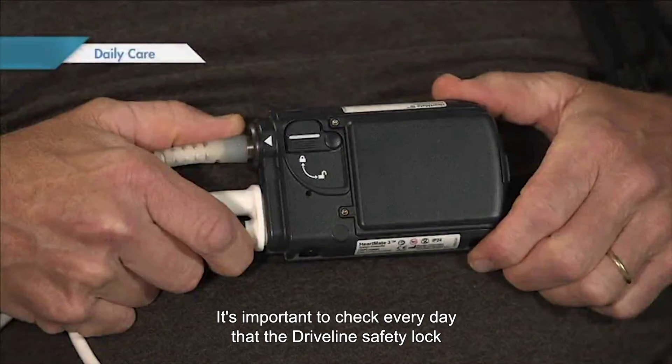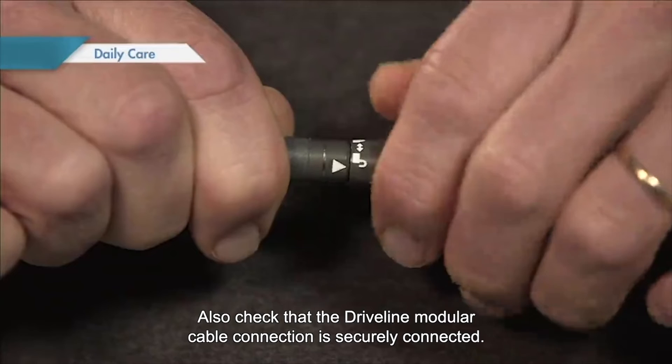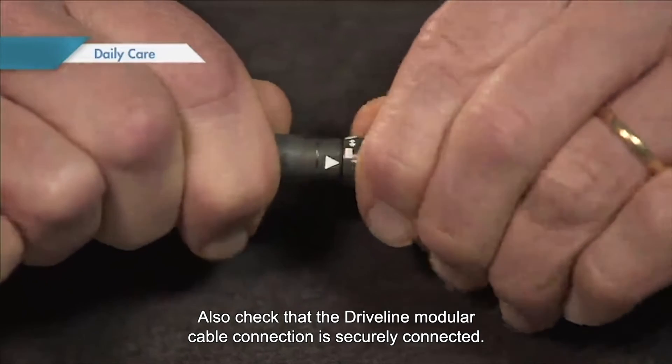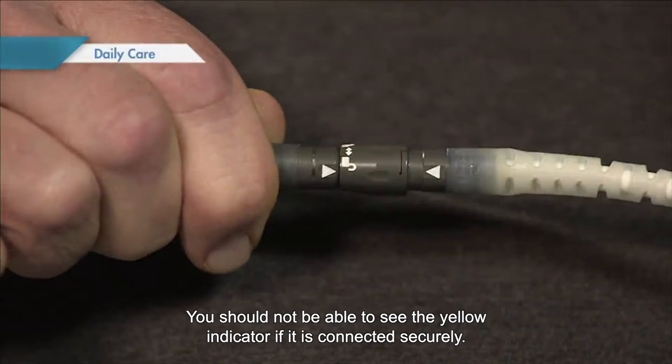It's important to check every day that the driveline safety lock is properly locked, covering the red release button. Also check that the driveline modular cable connection is securely connected. You should not be able to see the yellow indicator if it is connected securely.